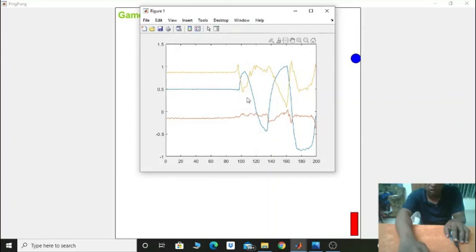This interactive game is mainly designed for the purpose of taking out the patient's anxiety and to make sure that the patient is comfortable while carrying out the exercise. So waveforms are anyway getting logged, so you will be able to track the patient's performance anyway.